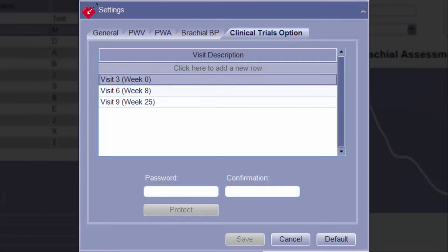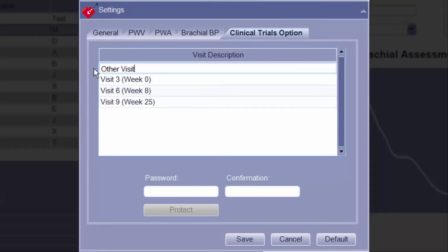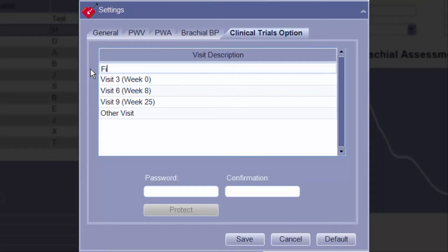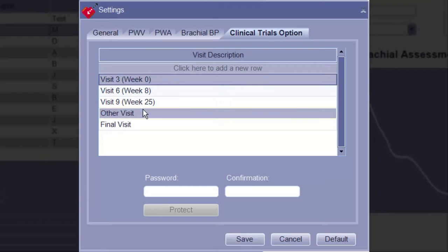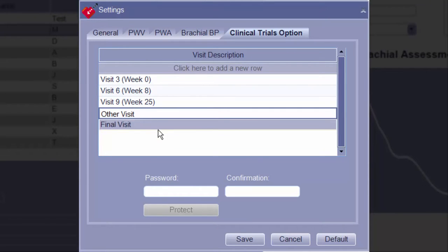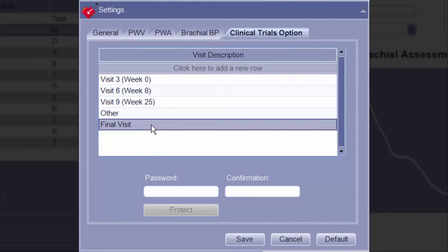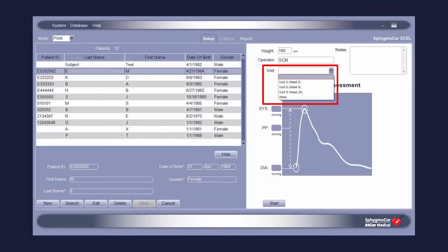The Visit field content is able to be customized under the Clinical Trials option tab. In the Visit Description window, click the top row to enable typing of a new visit name. Once named, click Enter and the visit name will be added in the Visit Description window. Multiple visit names can be entered. Any visit name can be edited by selecting that visit and double-clicking on it. Visits may also be deleted by selecting the visit and pressing Delete. Once the visit list is completed and saved, these custom visit names will appear in the drop-down menu on the setup screen.